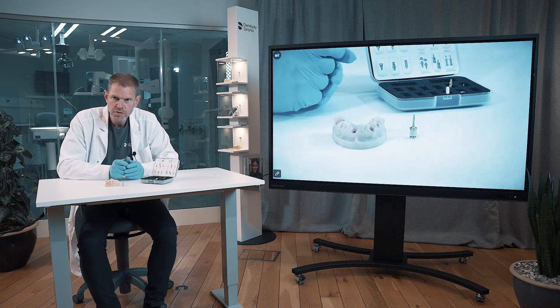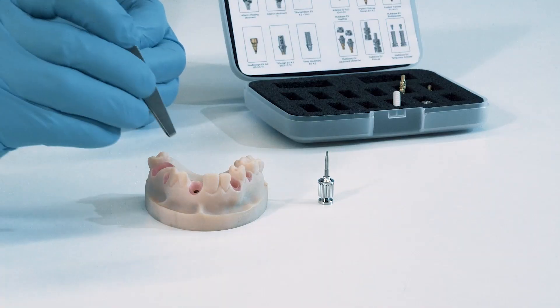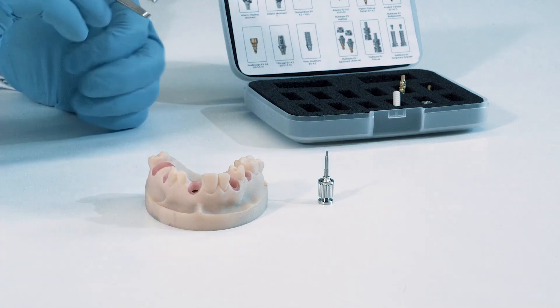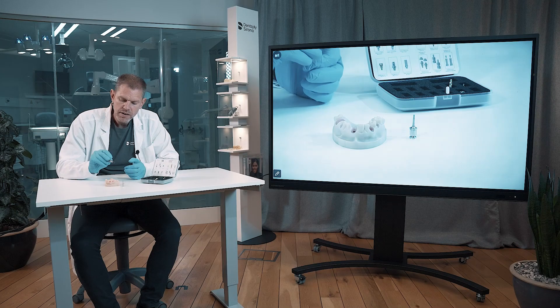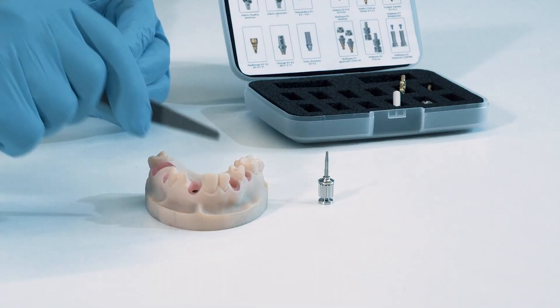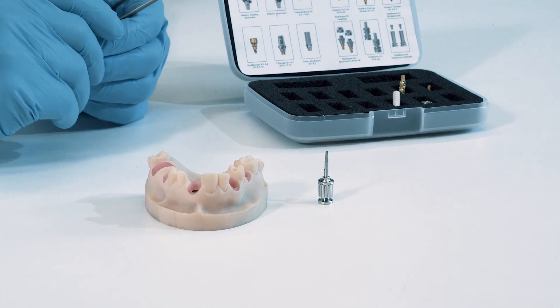We're going to look into two different healing abutment designs. We are going to put them into position number 2-1 and 1-3. The 2-1 position is for the Atlantis healing abutment, and the 1-3 is for the Healdesign EV.